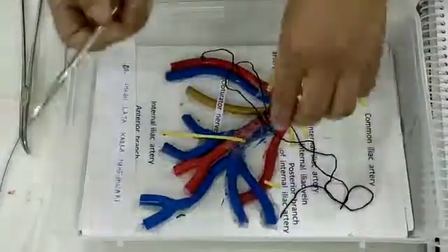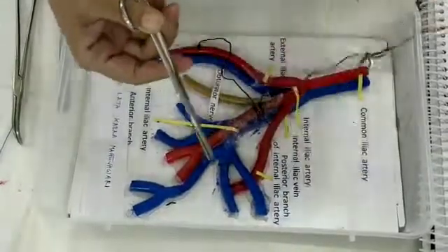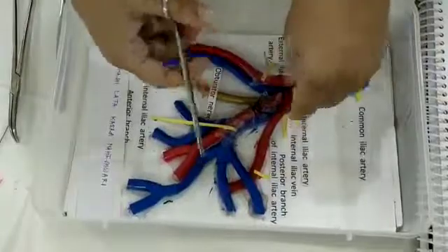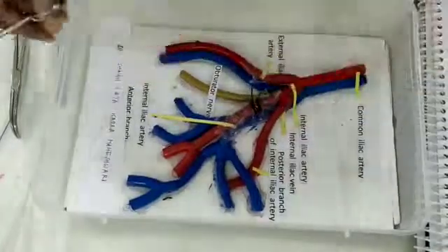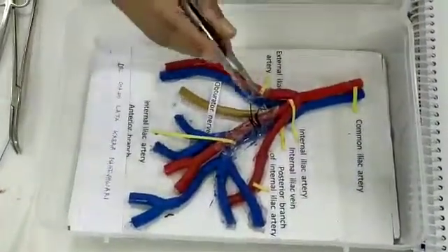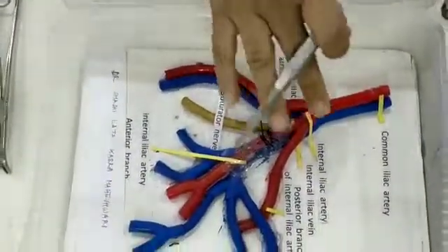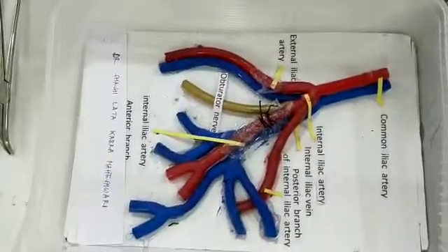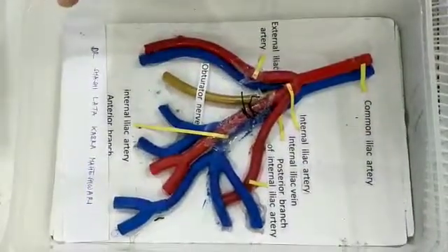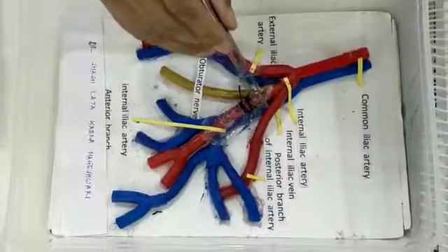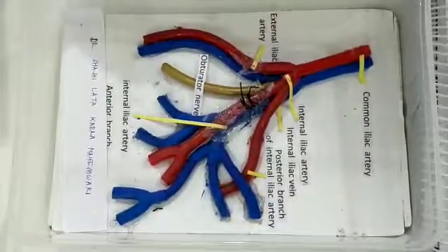Now very gently I cut the sutures without making any pull on the artery. This is the picture of internal iliac arterial ligation. Two or three important things: first, recognize the bifurcation after opening the retroperitoneum, and then locate the place where you have to apply the ligature. Measure a distance of two to three centimeters from the bifurcation.